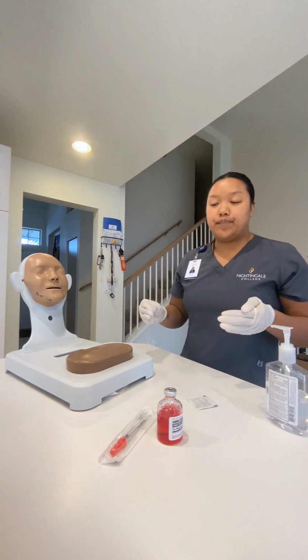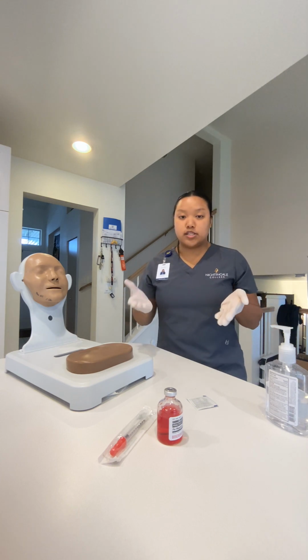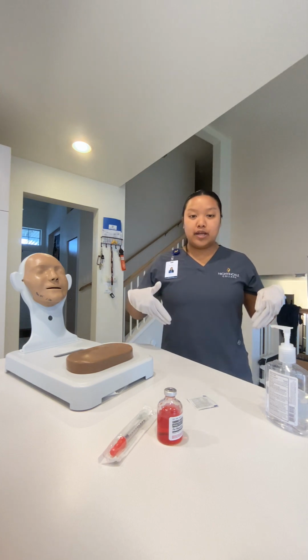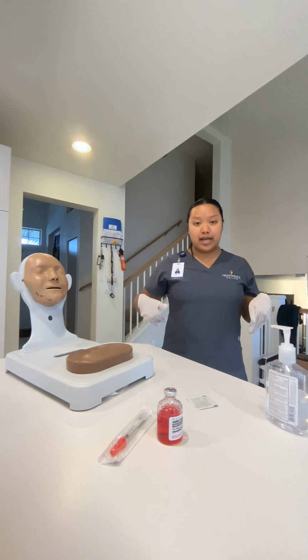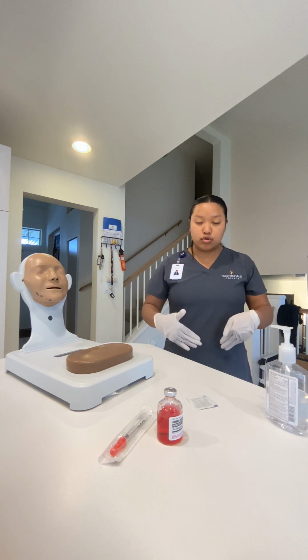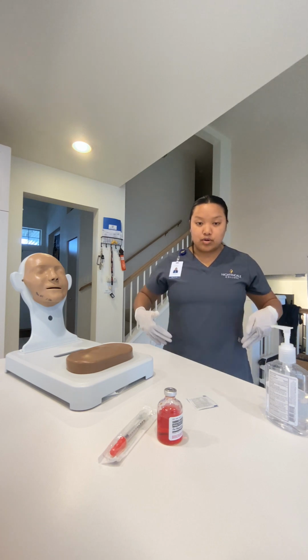And then, so like I said before, with the subcutaneous injections, you can do it in the upper arm, thigh, or your abdomen area. For her, I'll be injecting into the abdomen area, either the left or the right, and we want to make sure that it's the left or the right of the umbilical cord, so you don't want to go too close to your belly button area. So you want to go out here, that way you're able to pinch the skin, okay?